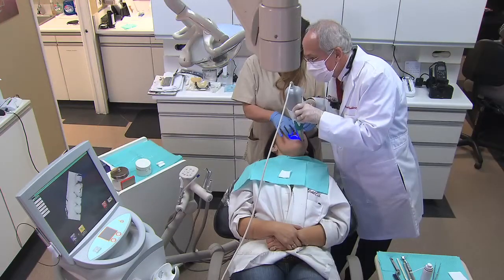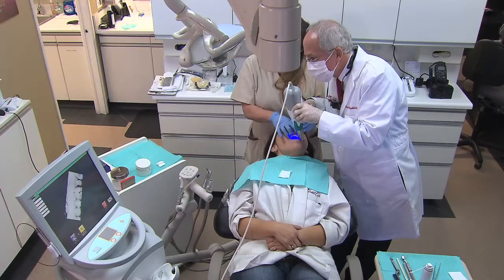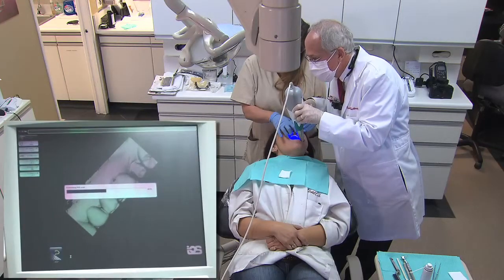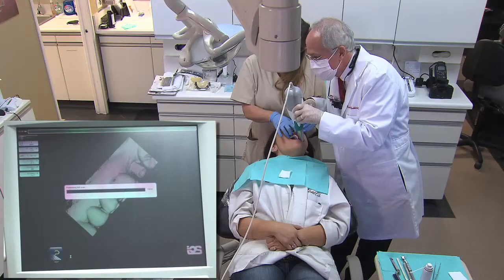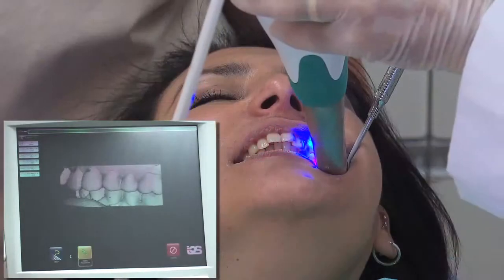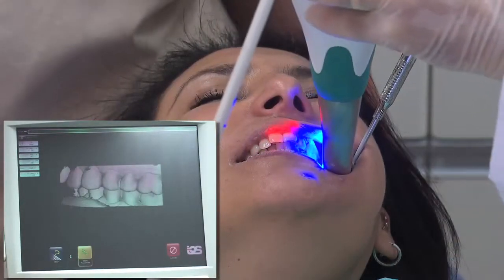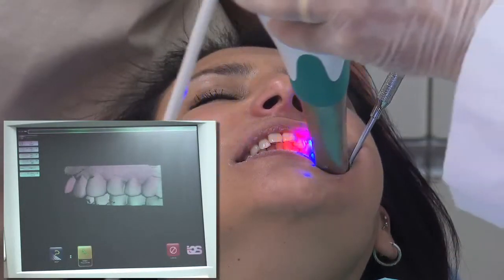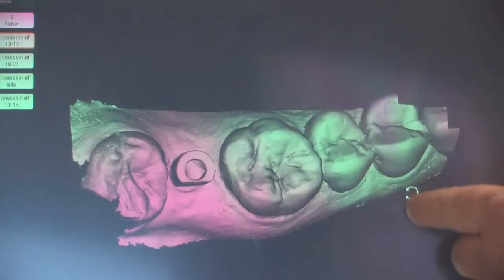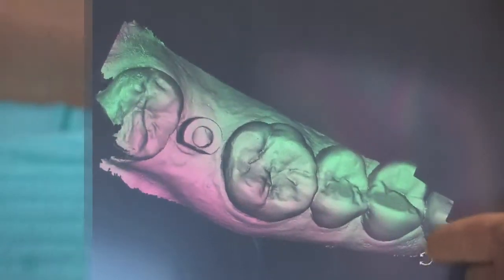One of the challenges in implant dentistry is to sculpt the soft tissues and then to transfer those contours to the laboratory model. This video will walk you through the use of BioTemps and the iOS FastScan Digital Impression System to do just that.